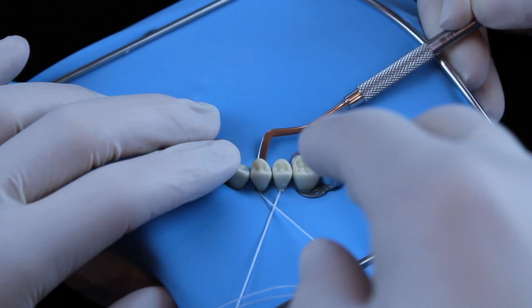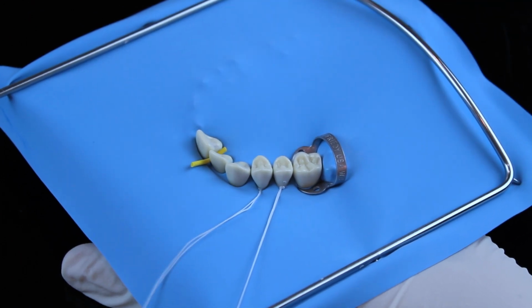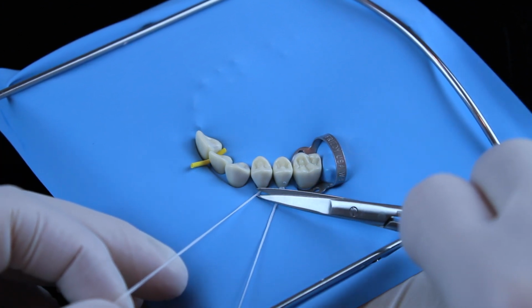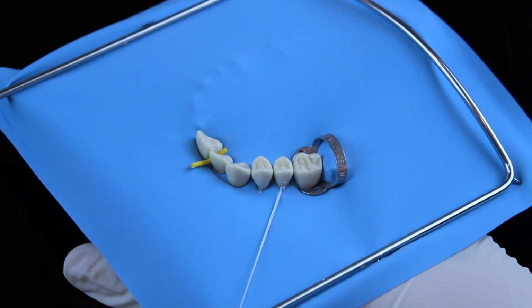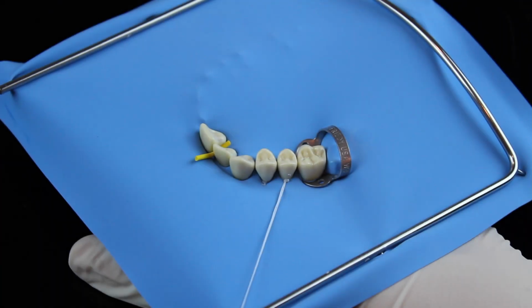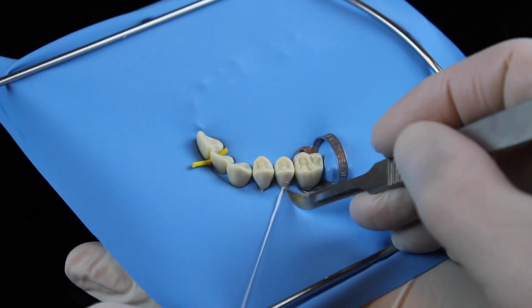We won't tie the floss to the frame this time, but just cut it short. We can use scissors or a number 12 scalpel blade for that. Removing the floss is easiest with a pair of sharp scissors or a number 12 scalpel blade.